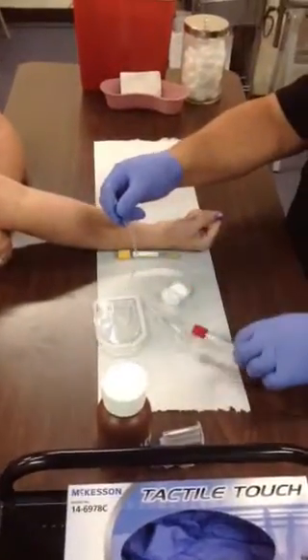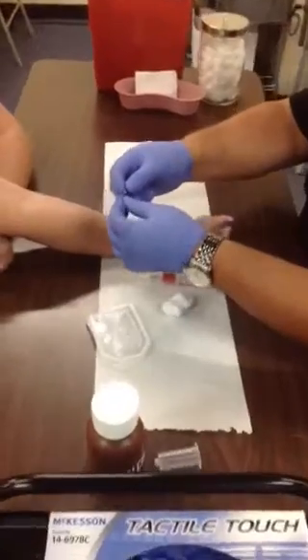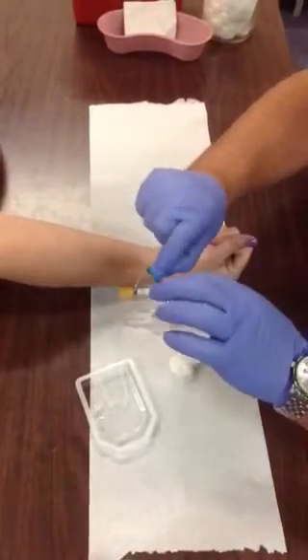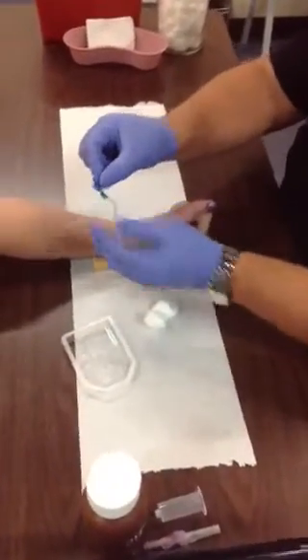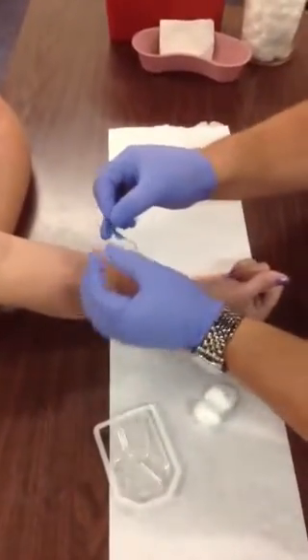We're going to take our first tube and place it on the back end — don't push it all the way through, just place it on the back end. Pull the wings together, and then with one hand hold the wings with the thumb and index finger. With the other hand, pull that cap off and set it down. Remember that the bevel has to be facing up. If your bevel's not facing up, just turn your wings the other direction.